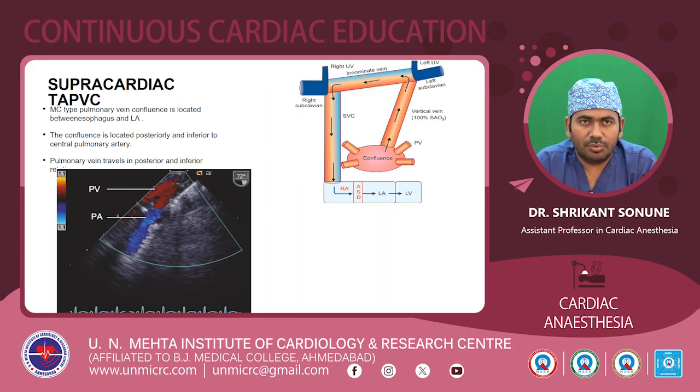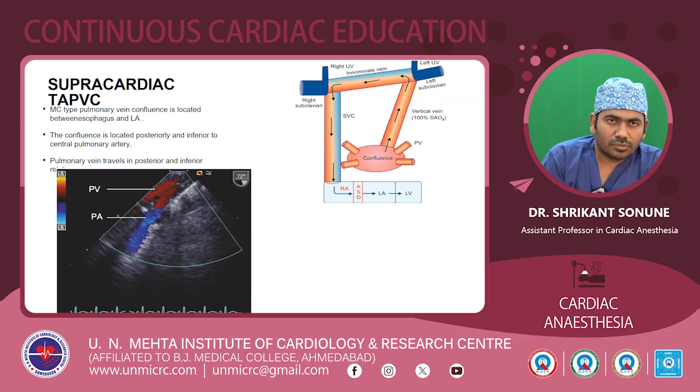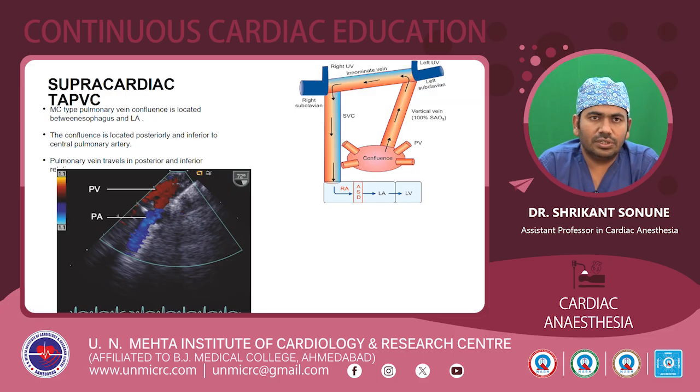Coming to the supracardiac TAPVC type, this is the most common type of TAPVC. The pulmonary vein confluence is located between the esophagus and the left atrium. The confluence is located posterior and inferior to the central pulmonary artery. As we can see in the echo image, the pulmonary vein is posterior and the pulmonary artery is anterior to it. This is a schematic diagram which shows the supracardiac type of TAPVC.